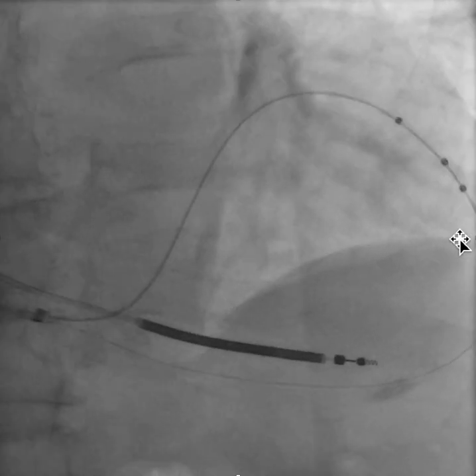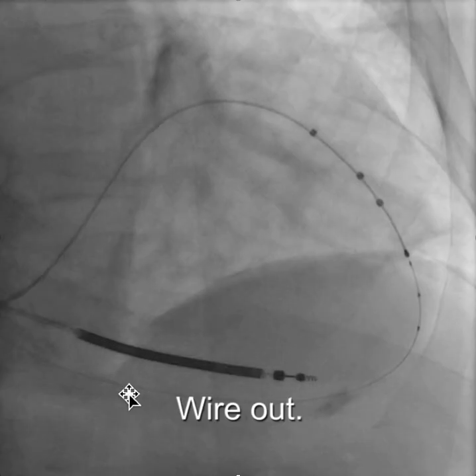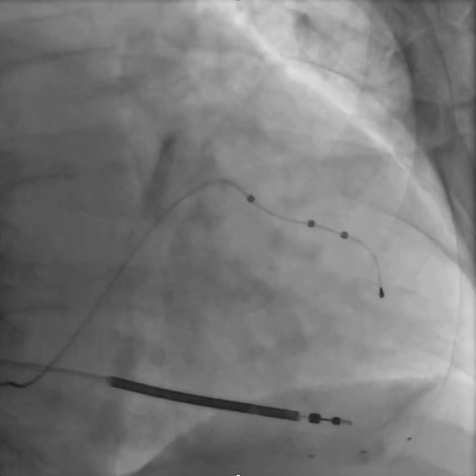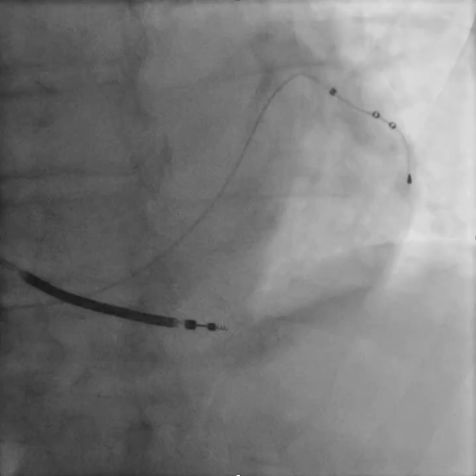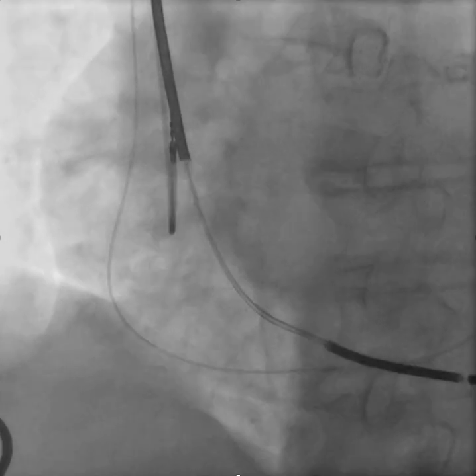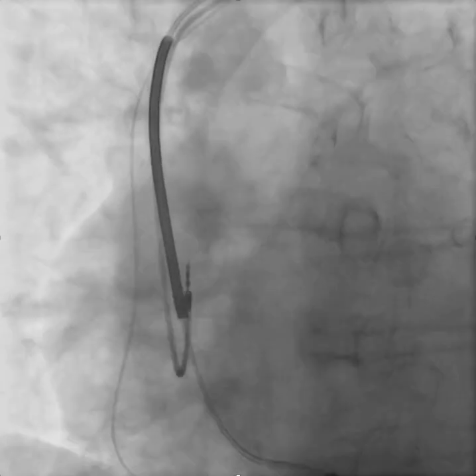The microcatheter has to come back — leads in, sheaths out, wires out. The details on how to perform the snare technique are contained on the YouTube channel. If you're interested in the antidromic snare technique, that video is available. This video is intended just to emphasize the use of the microcatheter. Thank you for your interest.